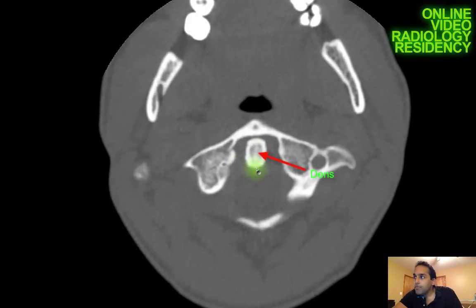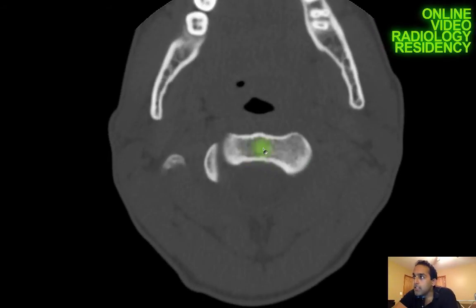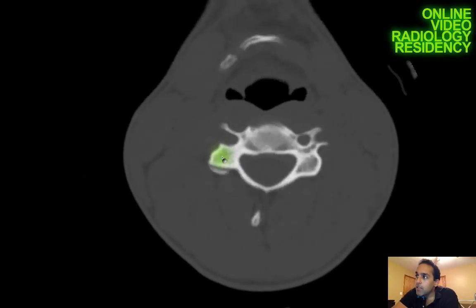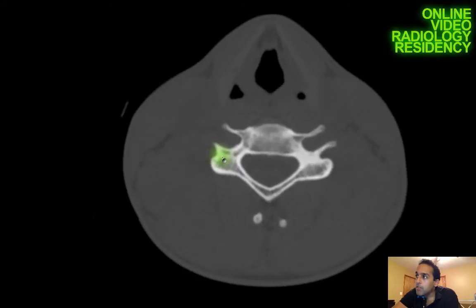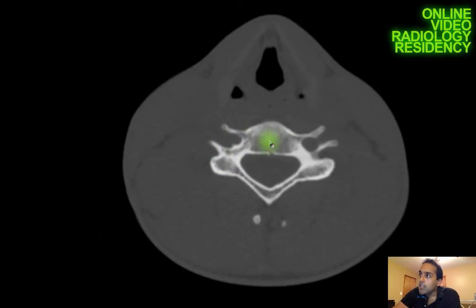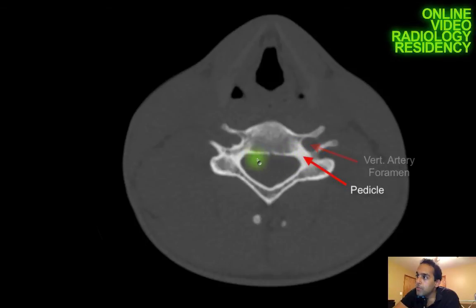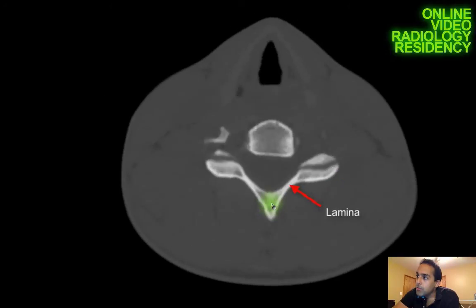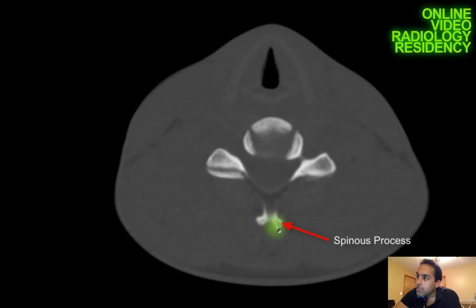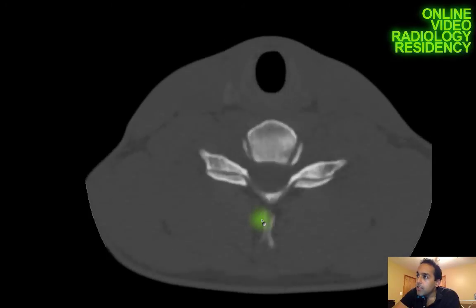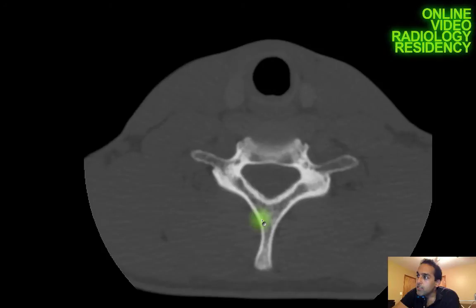I can see the dens poking up through the middle, and as I come down I can see the C2 vertebral body. At a typical cervical spinal level, I run through the anatomy at each level to exclude even subtle non-displaced fractures: the vertebral body, the transverse processes, the vertebral artery foramina, the pedicles bilaterally, the facet joints, and the laminae, which come together to form the spinous process — which is bifid in the cervical spine.